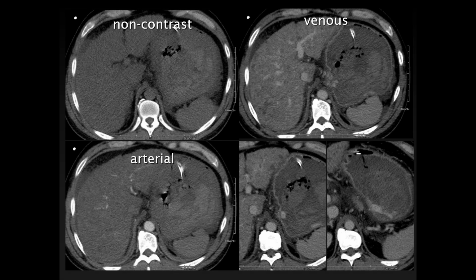Just an example, here is a patient who had a non-contrast scan. This was a patient who was found down and had a non-contrast CT. You see a lot of blood in the patient's stomach. In the arterial phase, there was really no source of bleed seen, and only in the delayed phase, in the venous phase, you can see that slowly some blood is accumulating here in the patient's stomach and then filling it. So there was a massive GI bleed that was only seen on a delayed phase.